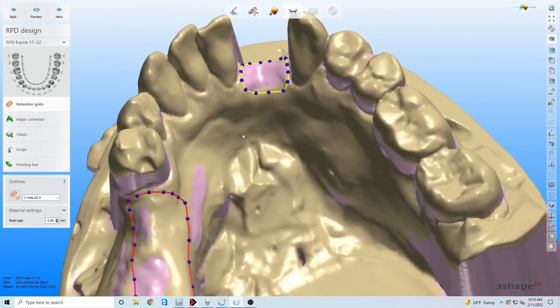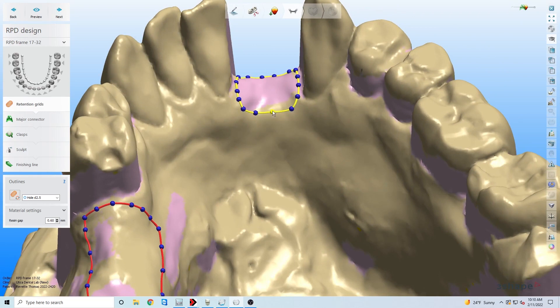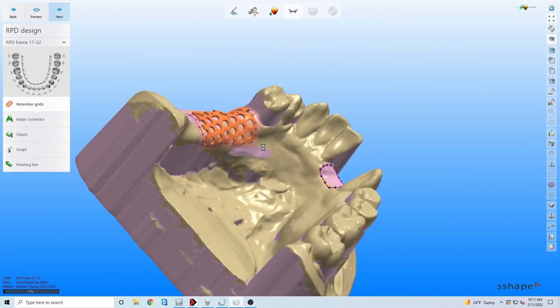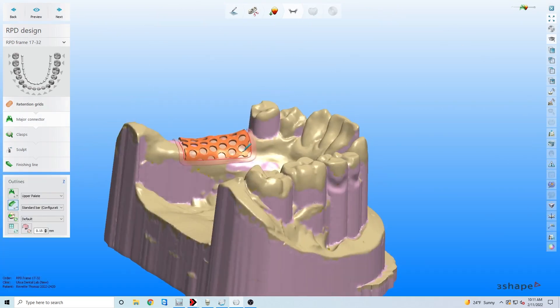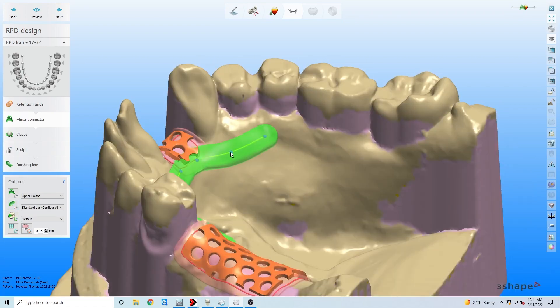Direct metal laser sintering - this additive 3D metal printing technique has completely superseded metal casting technology. Gone are the days of labor-intensive investing, casting, and finishing metal partial techniques. Now partial frames are CAD/CAM designed using a chromium cobalt metal alloy.